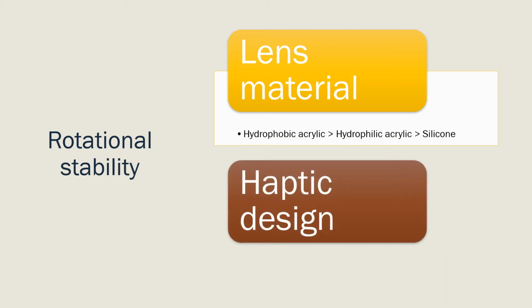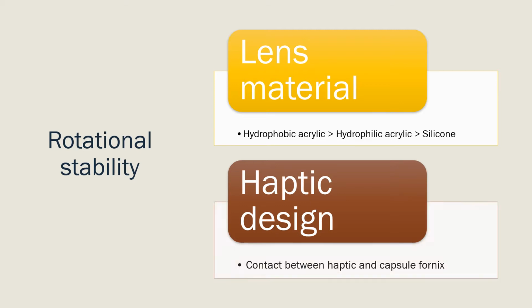The other key aspect is haptic design, and this is all to do with the amount of contact that there is between the haptic and the capsular fornix, and companies have come up with several different designs to try and achieve this.